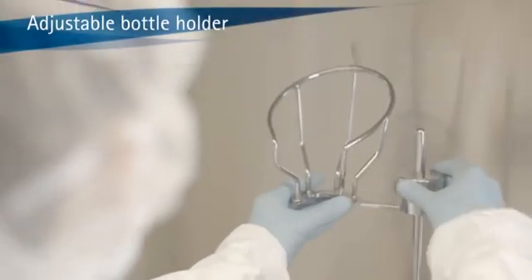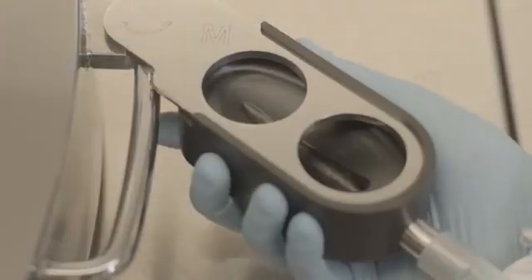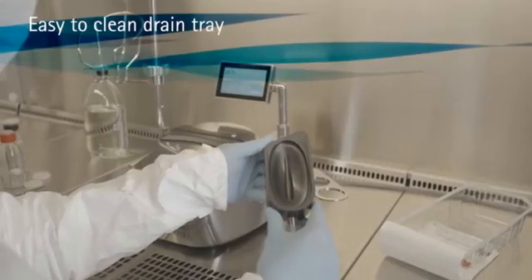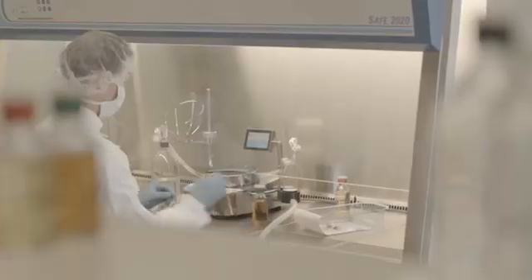You can also adjust the height and angular position of up to 2-liter bottles. Another important feature is the drain tray, which we designed to minimize splashing so no droplets go back to the canister.